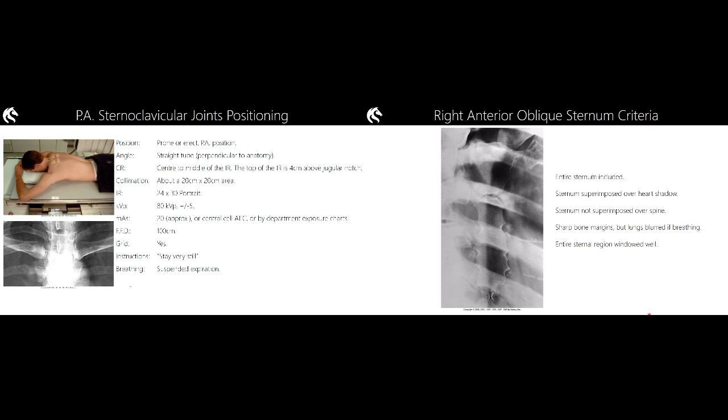The jugular notch is going to be right up against the board, so once again it's going to be that hand on the anterior, hand on the posterior to make sure that your centering point is correct, both supero-inferior and left and right. And it really is just as simple as that. Now, it's not going to be a particularly beautiful looking projection, because a lot of the time you're going to have a superimposition of the magnified spine over those SC joints. Okay, so it's not a great shot. This is only going to show gross pathology. For that reason, it's rarely performed.